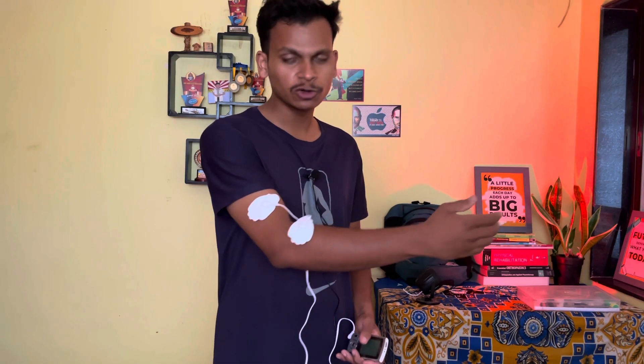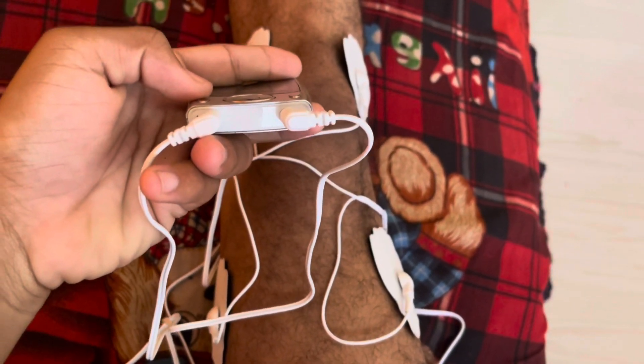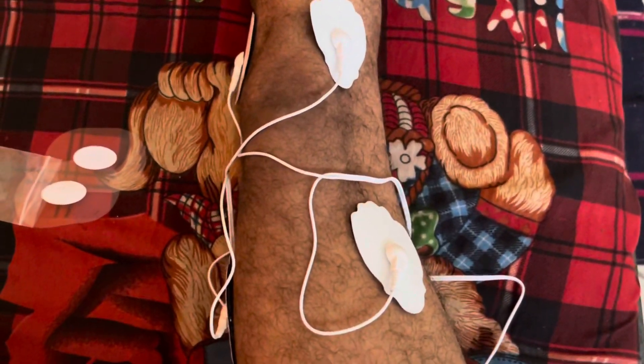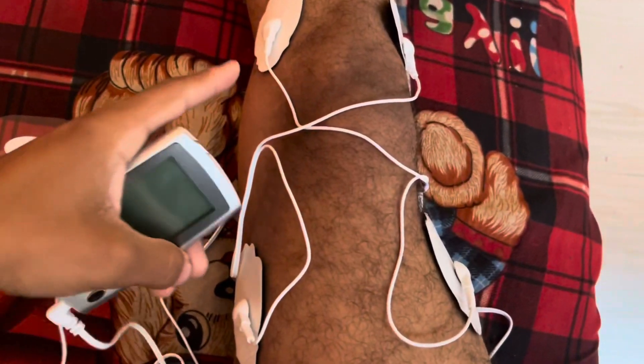After placing the electrodes, turn on the unit, then select a suitable time duration and comfortable mode depending upon your condition. For the knee joint, I will be using both channels and will create diagonal patterns with the electrodes, meaning two electrodes from channel A will be crossed with two electrodes from channel B. Electrode placement for different areas is different, which you will find in the user manual.